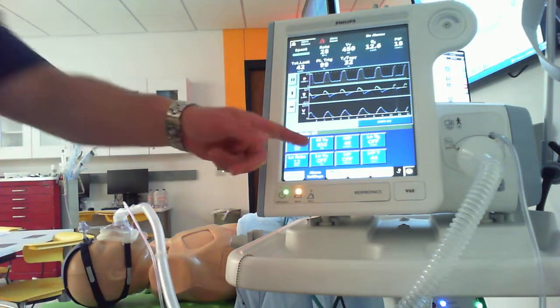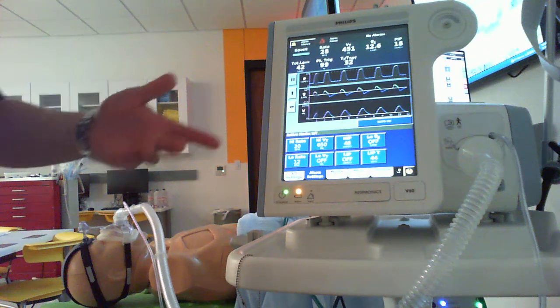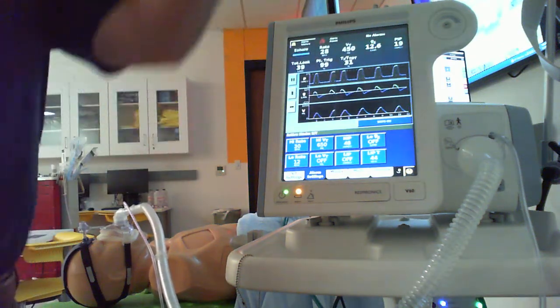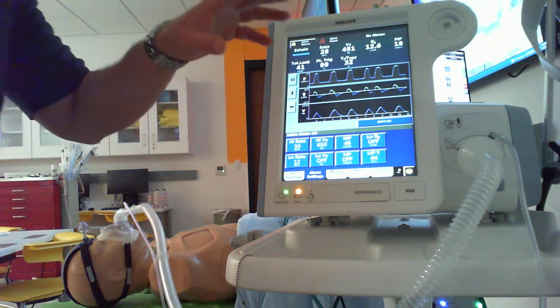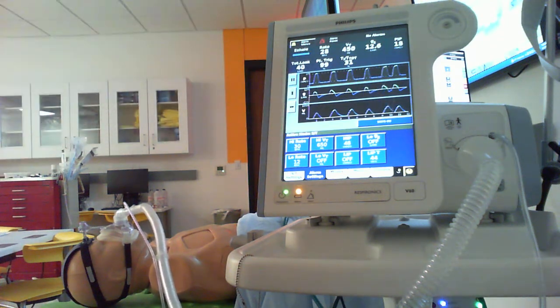Now keep in mind, just because you're hitting 650 doesn't mean that's what they're getting. It could be leaks, it could be estimated. It might happen intermittently, okay? But if it's going off constantly and that's how much support they're getting, I would want to go ahead and consider readjusting my settings, making sure everything is good with the mask.